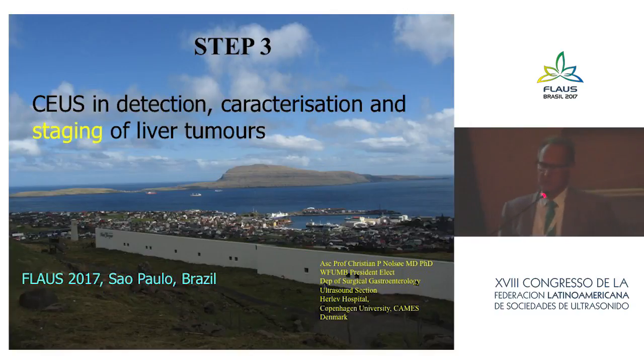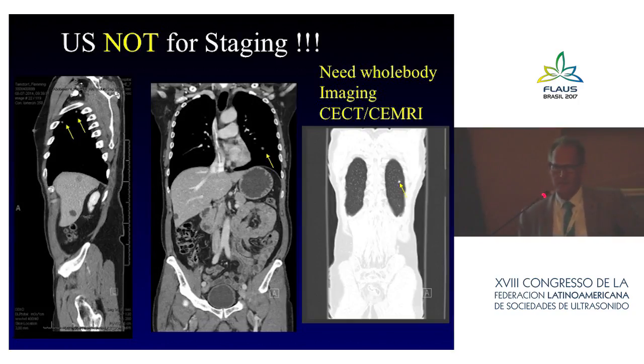Okay, what about CEUS and staging? Is CEUS, or is ultrasound, good for staging? Well, no. For staging of cancer, you need whole body imaging, and usually ultrasound is not very good for that. Ultrasound, first of all, would never pick up small nodules in the lungs, but also we do not get the big picture. So for staging, CEUS, and ultrasound generally, is not the best.